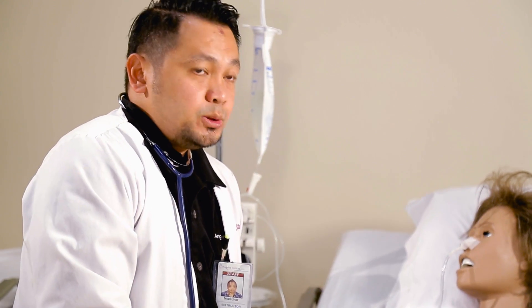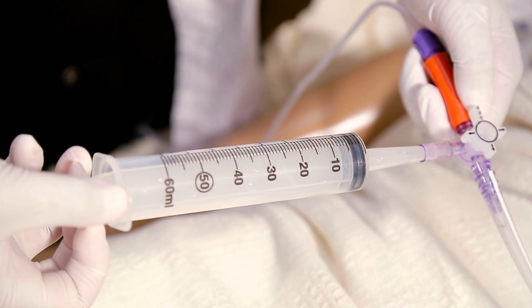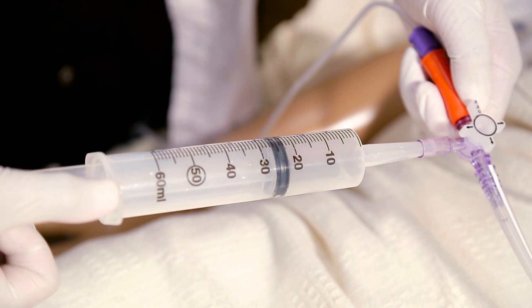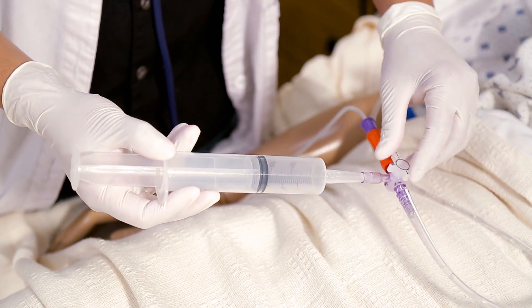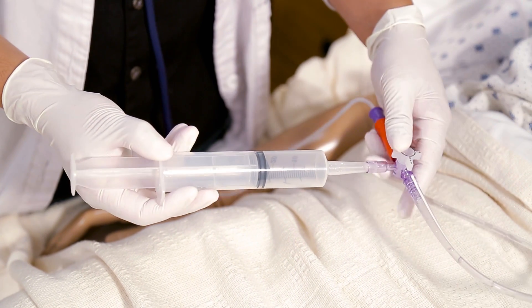Check for residual by drawing the syringe back, and if you feel any kind of resistance, it's considered normal. Any residual that's above 100 cc, we need to hold the medication and stop the feeding.